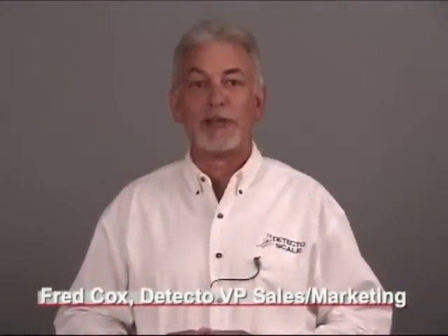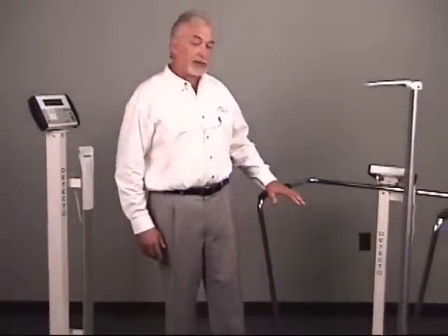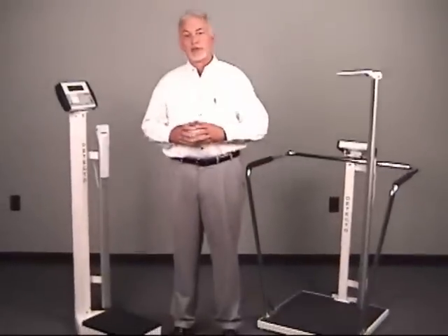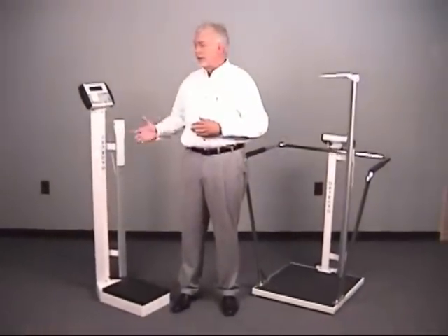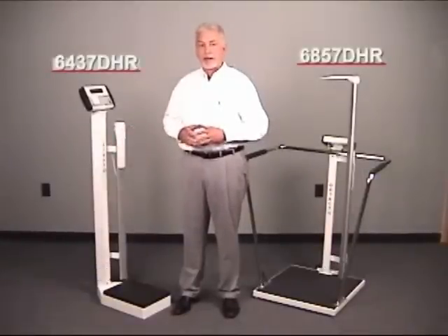Detecto is the name most recognized in the medical industry for high-quality USA-made scale products. The 6437 DHR and the 6857 DHR incorporate Detecto's digital height rod technology. This technology allows you to see digital height, weight, and body mass index simultaneously.